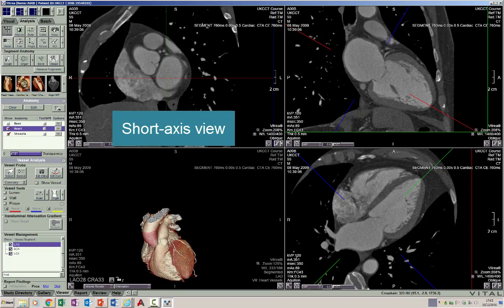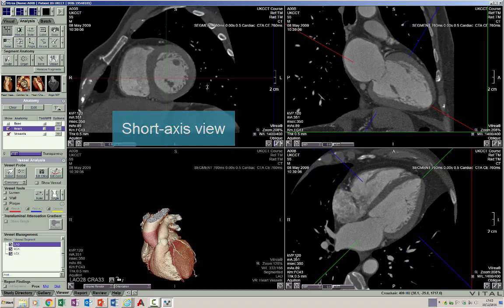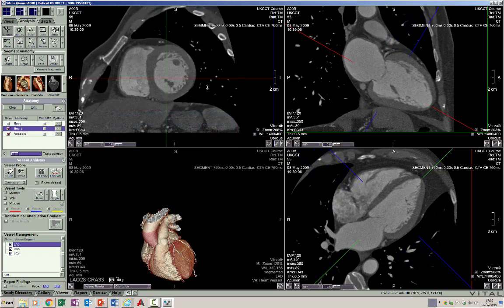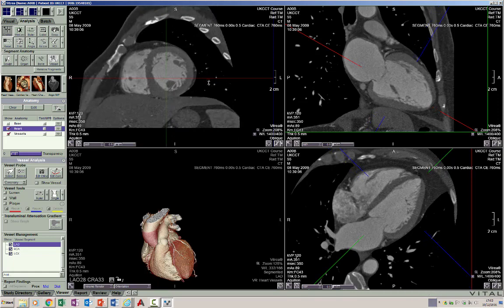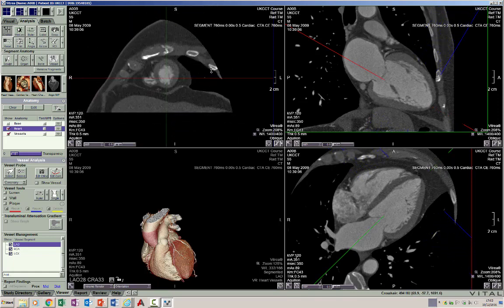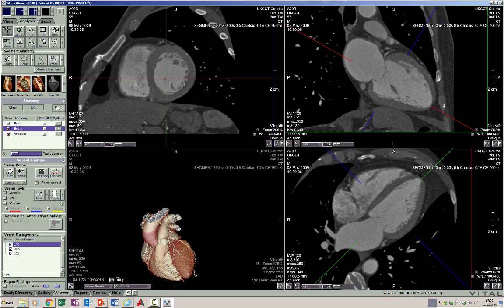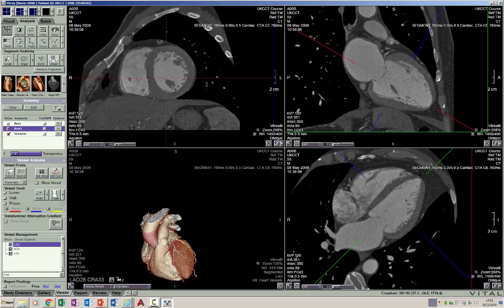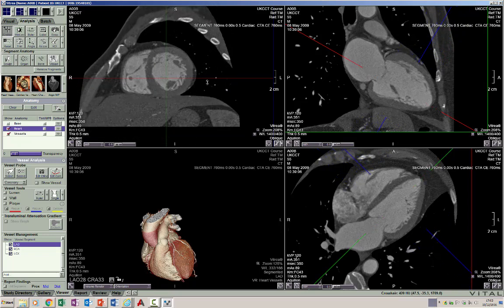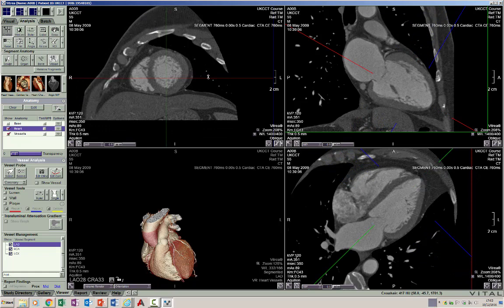On CT we can scroll through any of these planes to study them in more detail in terms of anatomy and different abnormalities that we may see. Let's look at the anatomy of the cardiac chambers in more detail.